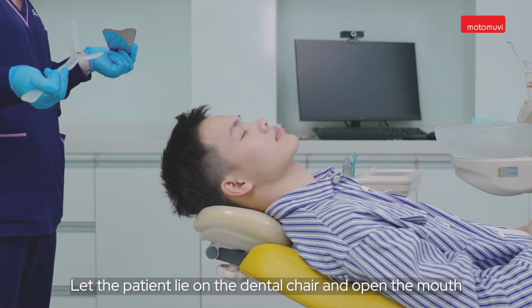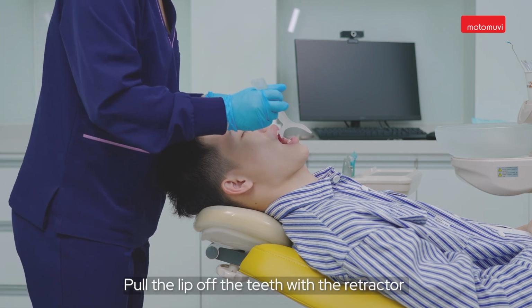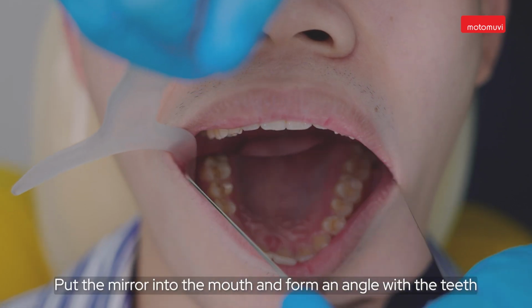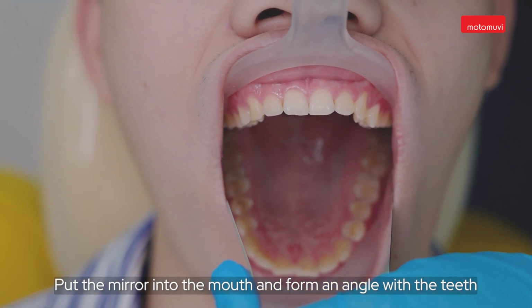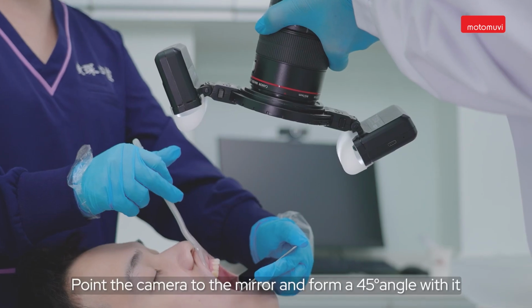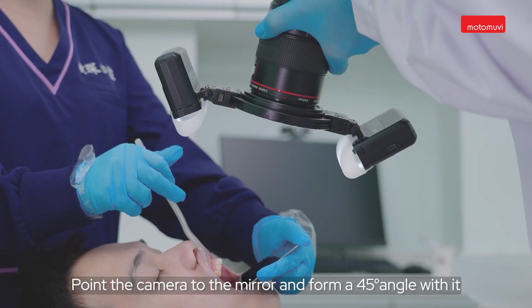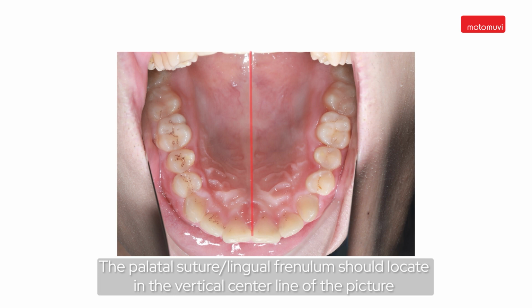Let the patient lie on the dental chair and open the mouth. Pull the lips off the teeth with the retractor. Put the mirror into the mouth and form an angle with the teeth. The camera position is in front of the patient. Point the camera to the mirror and form a 45-degree angle with it. The occlusal surfaces of the upper and lower teeth are visible. The palatal suture and lingual frenulum should be located in the vertical central line of the picture.